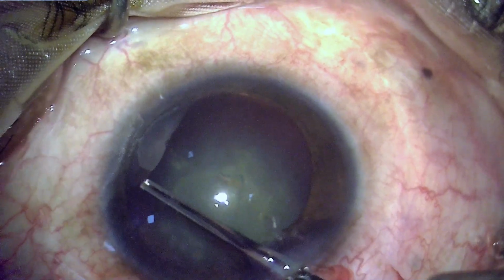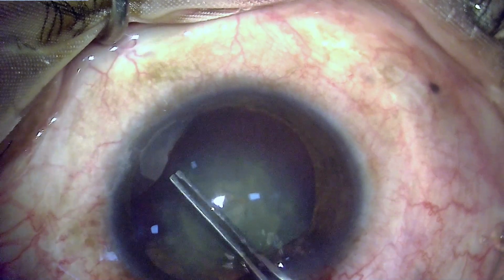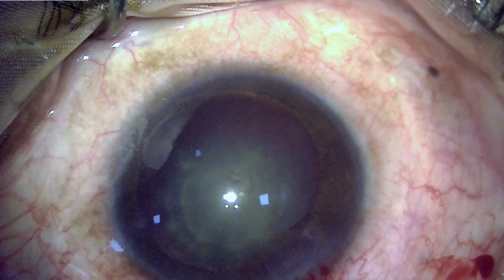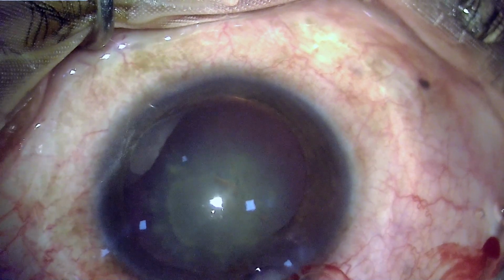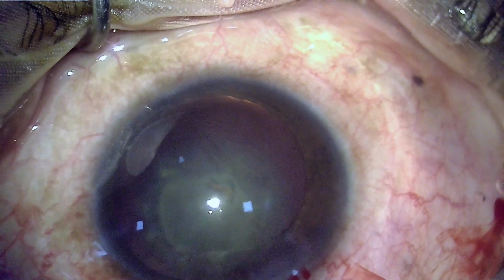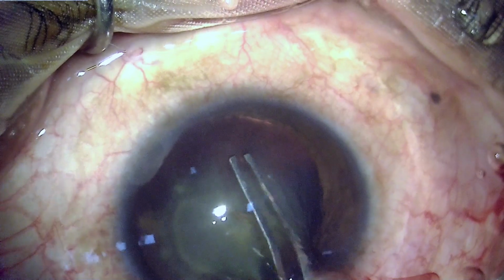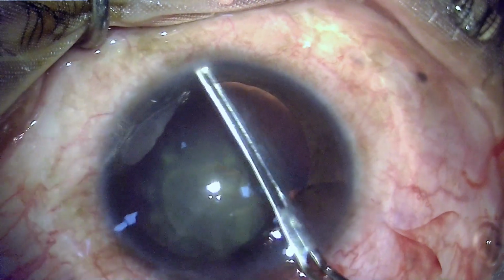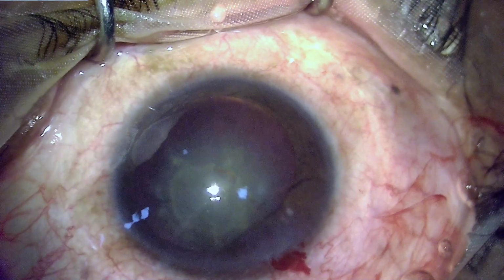These eyes usually have some amount of emulsified oil in the anterior chamber, which is automatically drained the moment we make entry for the anterior chamber paracentesis. So even if there is some amount of emulsified oil, you don't have to do anything extra. Capsulotomy is usually not an issue because there are no pathological changes whatsoever in the capsule and the behavior is absolutely normal. Creating a side port.